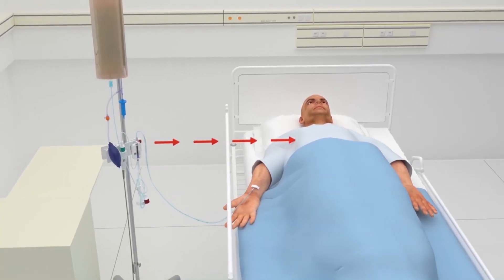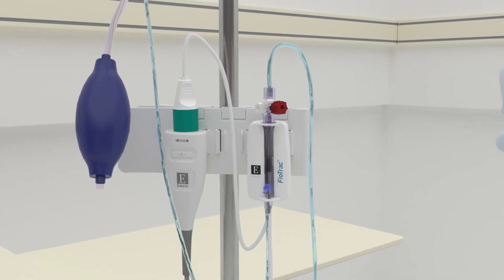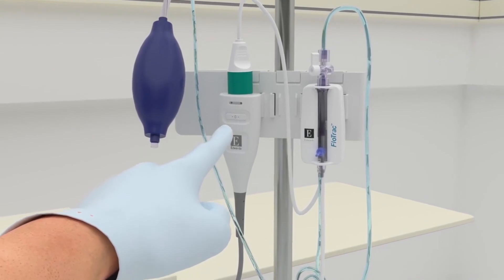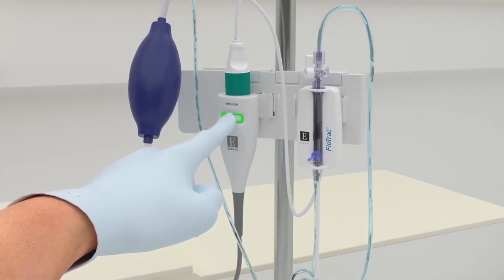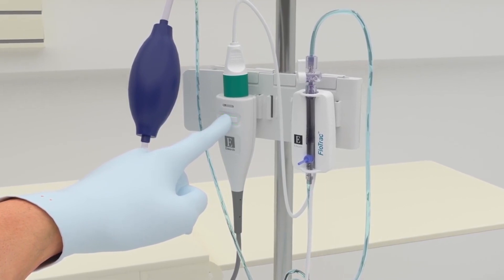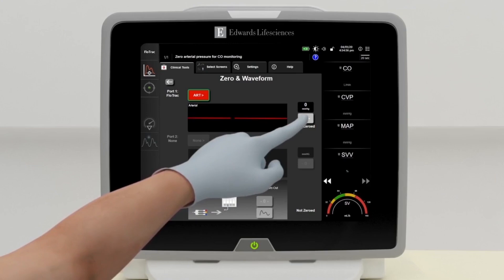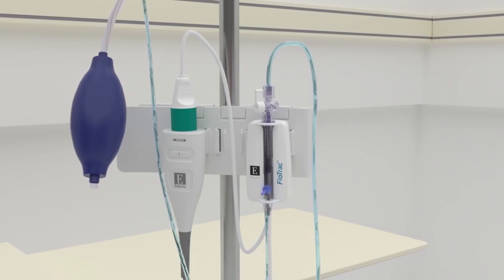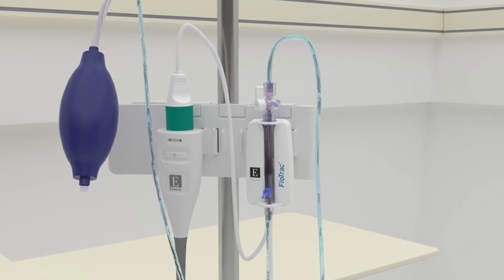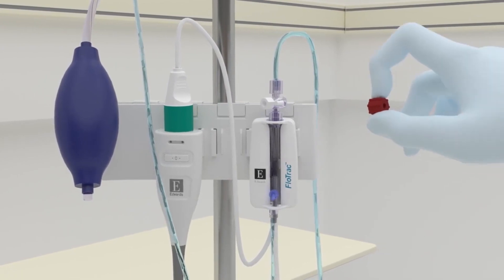Level the FlowTrack sensor to the phlebostatic axis. Open the FlowTrack sensor to atmospheric air. Hold down the zero button for three seconds to pull up the zero screen, then hold down the zero button for an additional three seconds to zero, or press the zero button on the screen to zero. Zero the bedside monitor to atmospheric air per the monitor's instructions. Return the stopcock to original position and replace the cap.